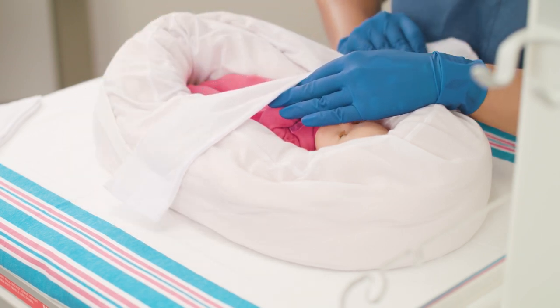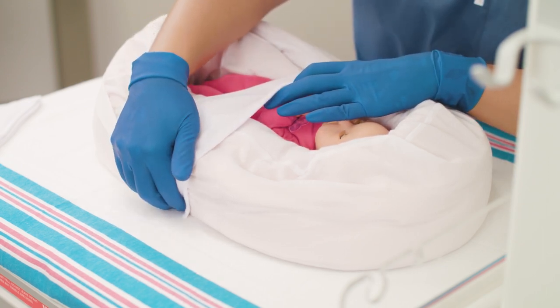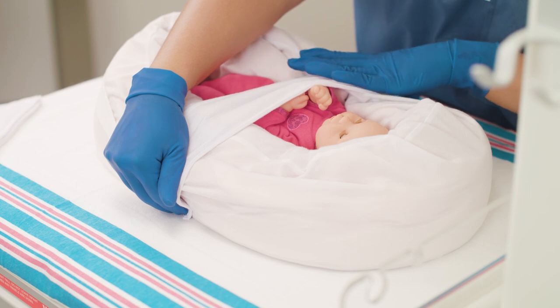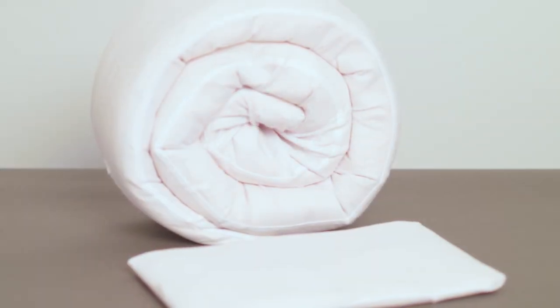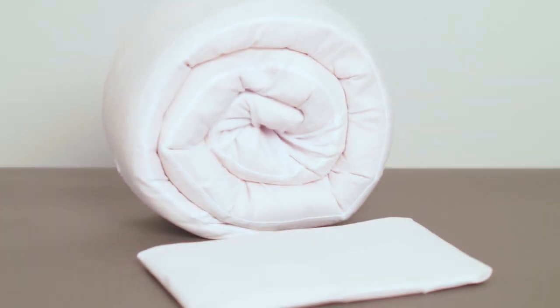This video demonstrates the use of the fluidized tube positioner to achieve a contained position for a baby in supine, lateral, and prone positions. The fluidized positioner tube is used in conjunction with a fluidized body positioner and comes in small and large sizes.